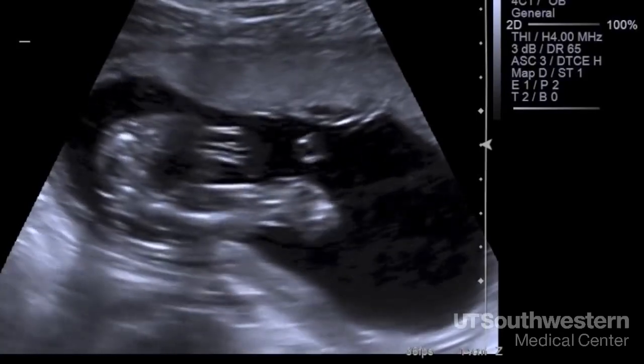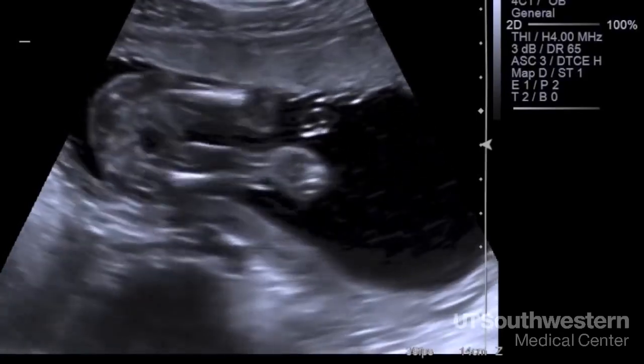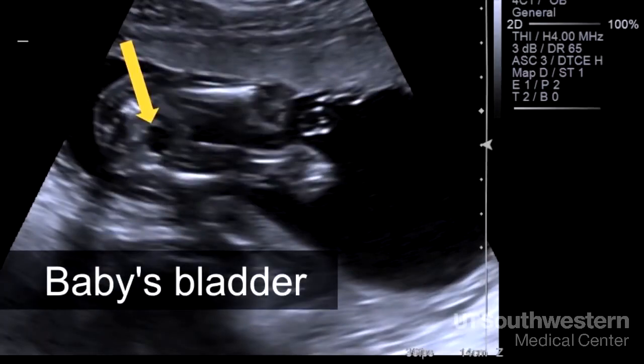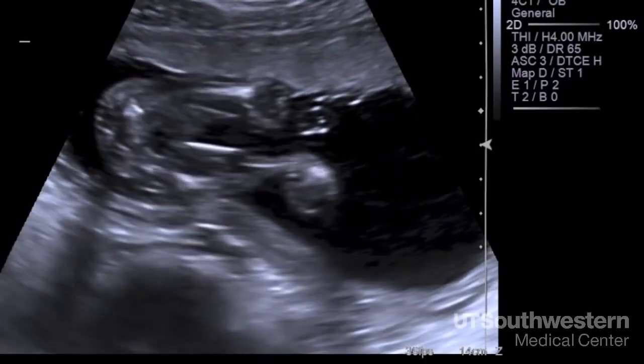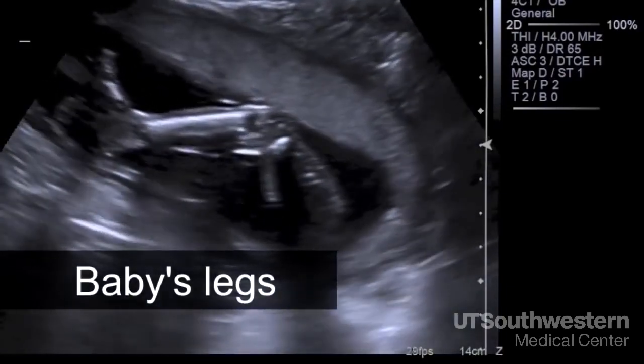And finally, all the way down in the baby's pelvis, we see another black dot, which is the baby's bladder. That tells us that the kidneys, which earlier we saw appear normal, are functioning and producing urine. Here are the baby's legs. They are extended and we see both of them moving.